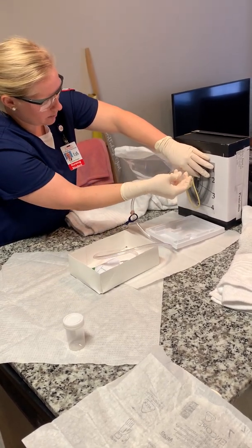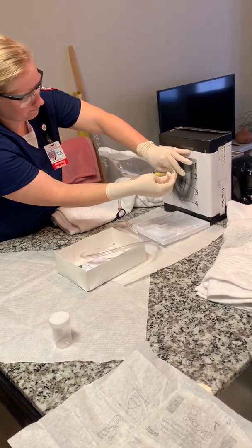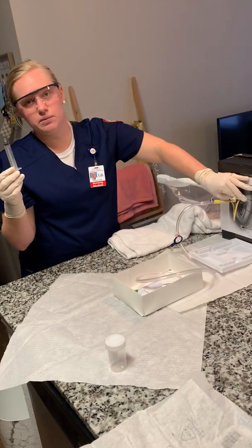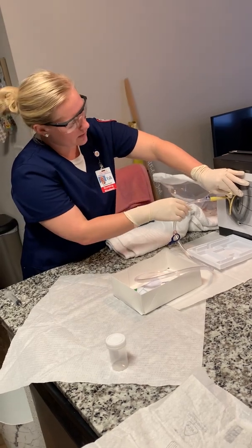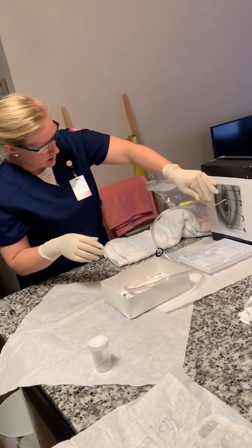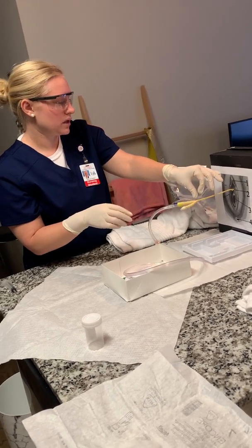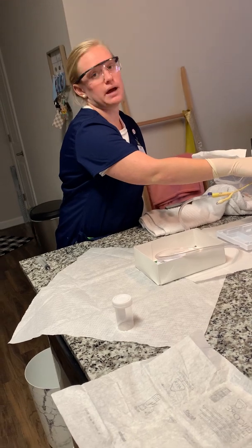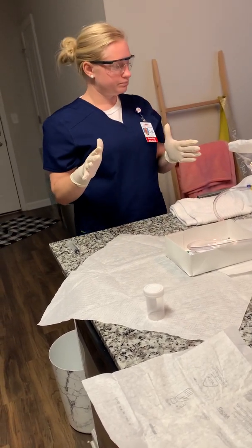And come up here and hold pressure. Take it off. I would usually disregard this, but I'm going to keep it because I'm going to need it later for today. So I'm going to put that down. And then I would pull it back slightly and then push it back in.